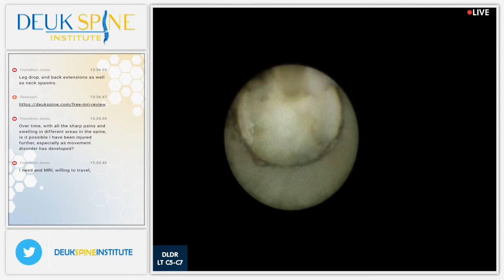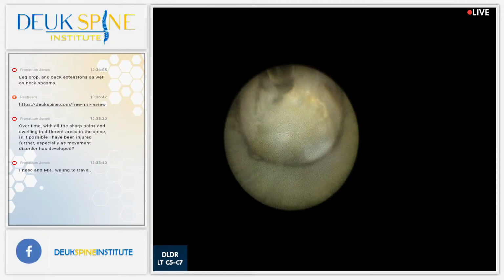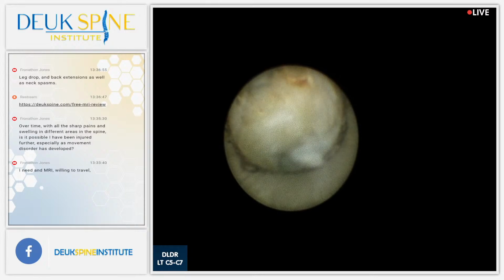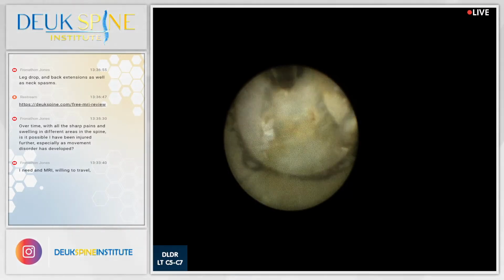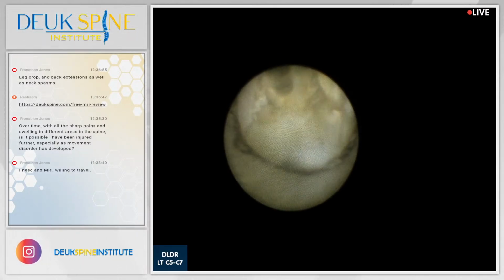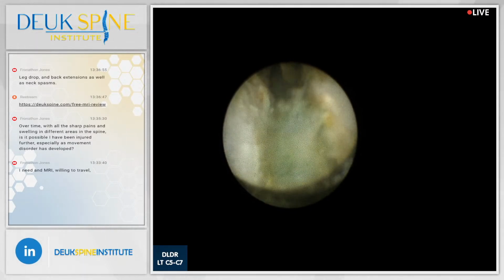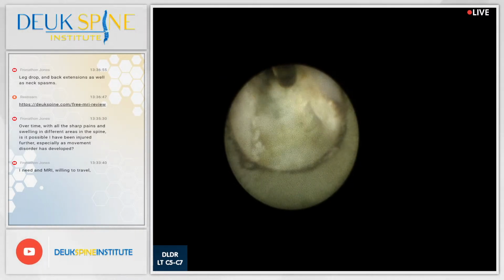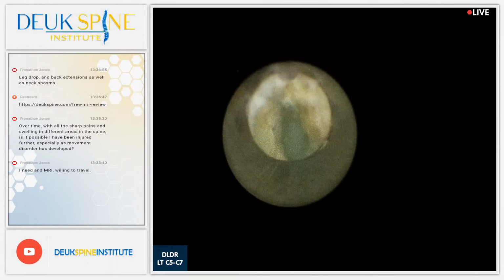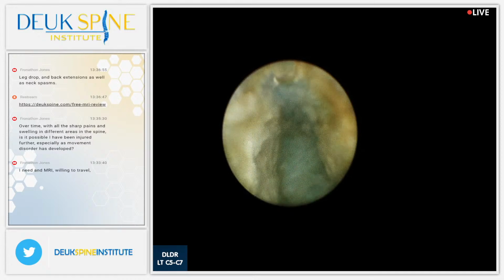All right, just about done with this one. I do have to open this area up more to make sure there's not a herniation behind it, because I don't want to accidentally leave something here that we should have taken out while we were here. These are all scarred fibers of what's called the posterior longitudinal ligament. That's the neural foramen on the right. That's where the biggest part of the herniation was. I do have to look here, and I've got to look in one more spot as well. This is all still some herniation. I got to get rid of this.